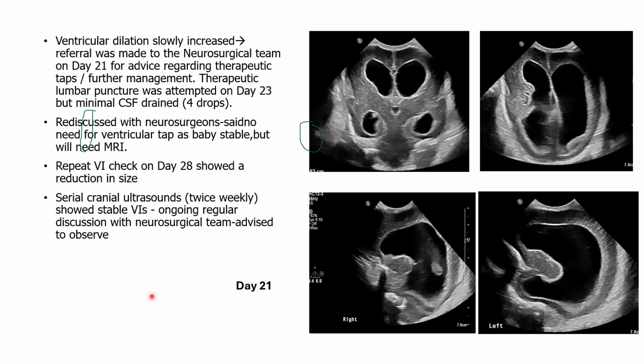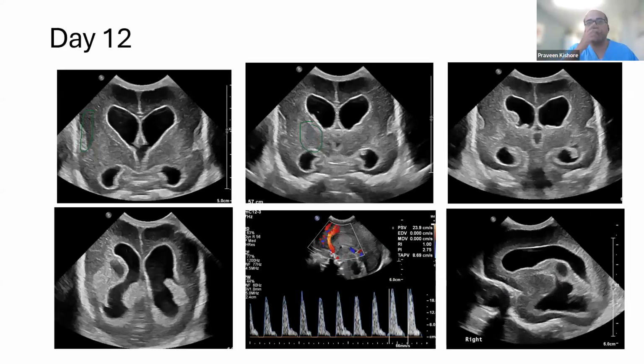Doctor, is it okay if I ask a question about the previous slide? Yeah. I'm not sure, but the area around the ventricles is a bit hyperechoic. Could it be ventriculitis also?